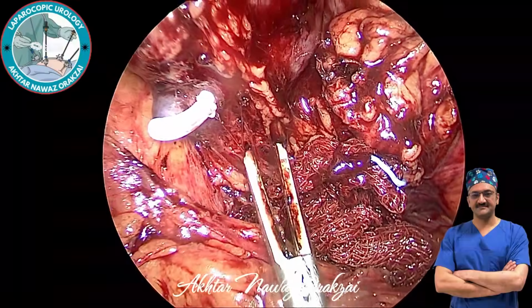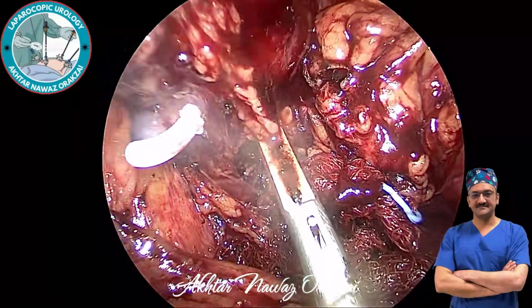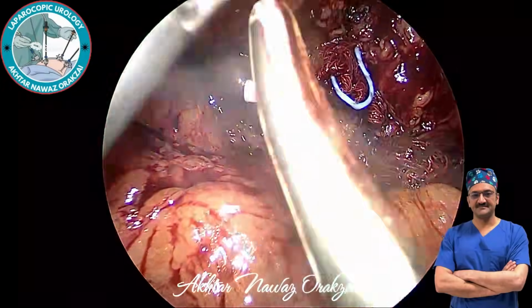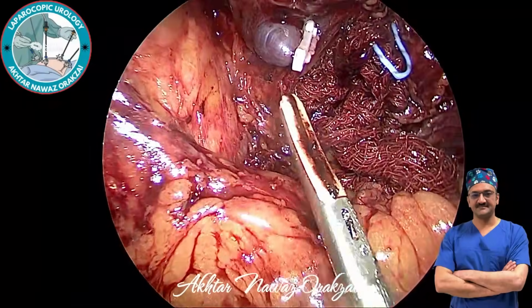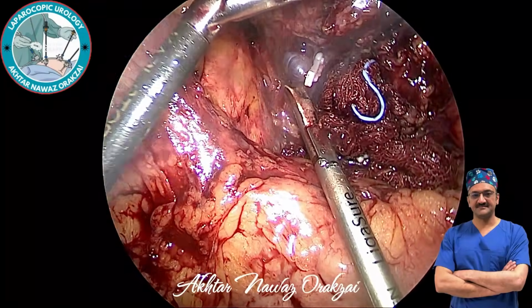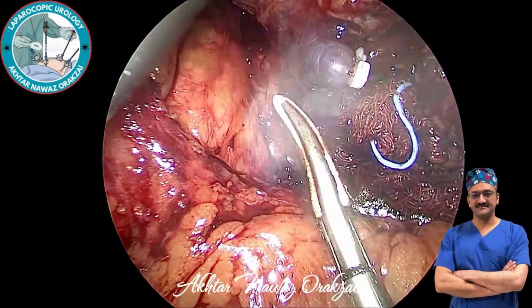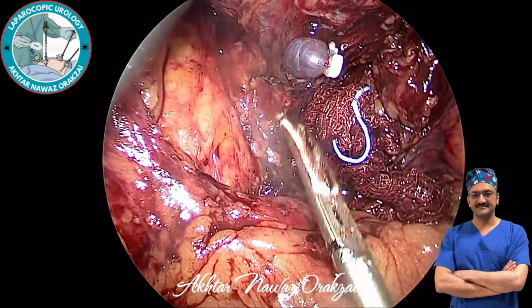Now dissecting the portion of the adrenal gland towards the aorta. Here we will be seeing a small artery which is coming from the aorta towards the adrenal gland. And to be honest, we were unable to identify any superior adrenal artery.